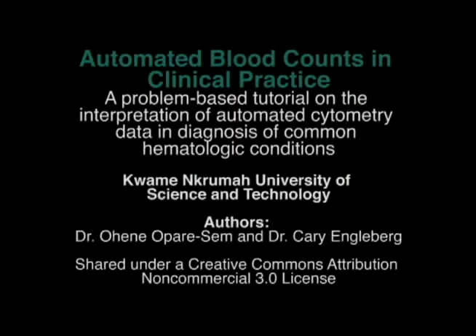The automated counter would examine thousands of cells, but then translate that information into statistical data that are very useful to unraveling pathology. Nowadays, almost all the regional hospitals have automated blood cell counters. That's how available they are in the world at large. And yet, the understanding of their results lags behind their availability.